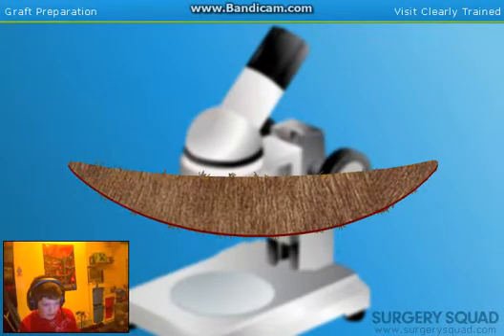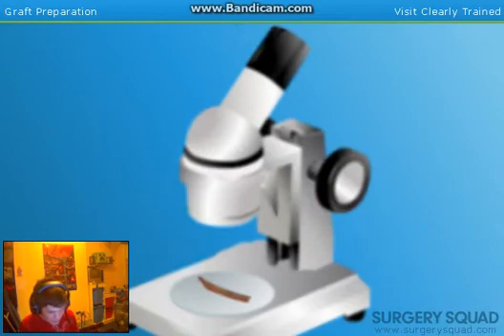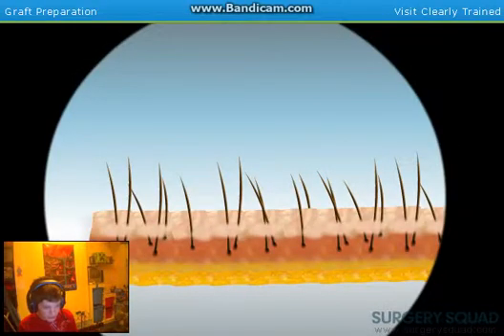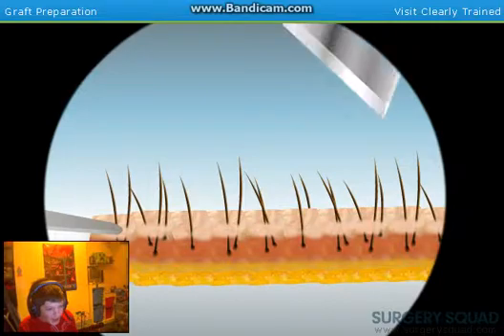The first thing that we need to do is cut the removed scalp into sections. We'll dissect this one section of skin while our medical assistants take care of the others. Let's remove the individual follicles from the donor material using a pair of tweezers and a sterile razor.